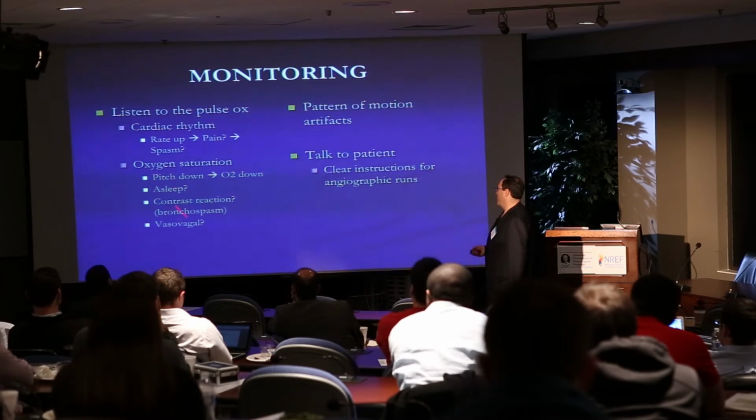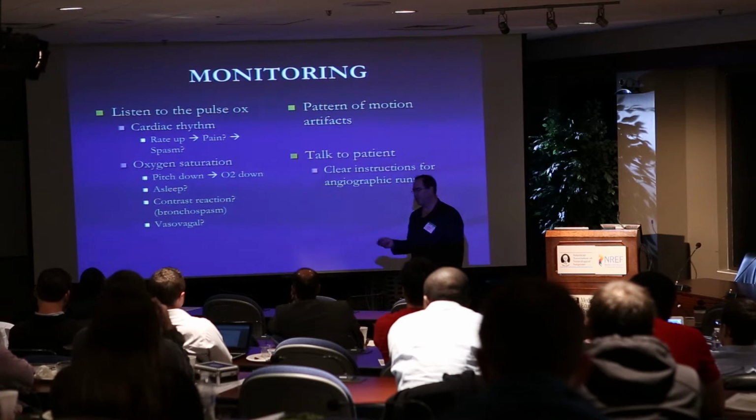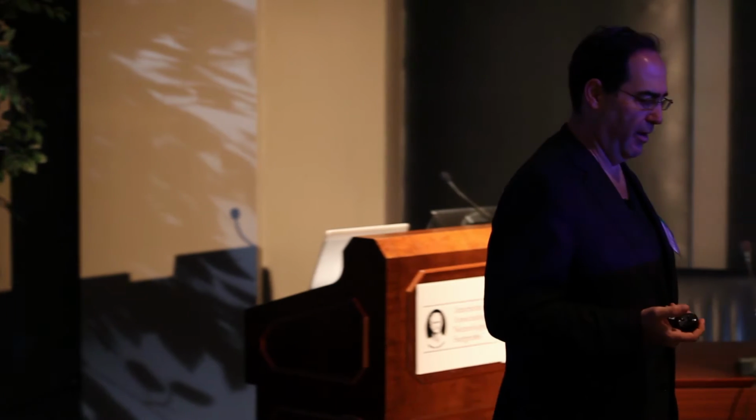Obviously, monitoring when you're doing conscious sedation, this is particularly important. Obviously, when you're doing general anesthesia, I like to hear the cardiac monitor in the background, especially when I'm doing particle embolization. So when I'm doing embo for tumors, I time it to the cardiac cycle. You hear the cardiac monitor beep and you give a little push and you can see the contrast go through. That's how I teach the residents and fellows, and that's how I was taught.